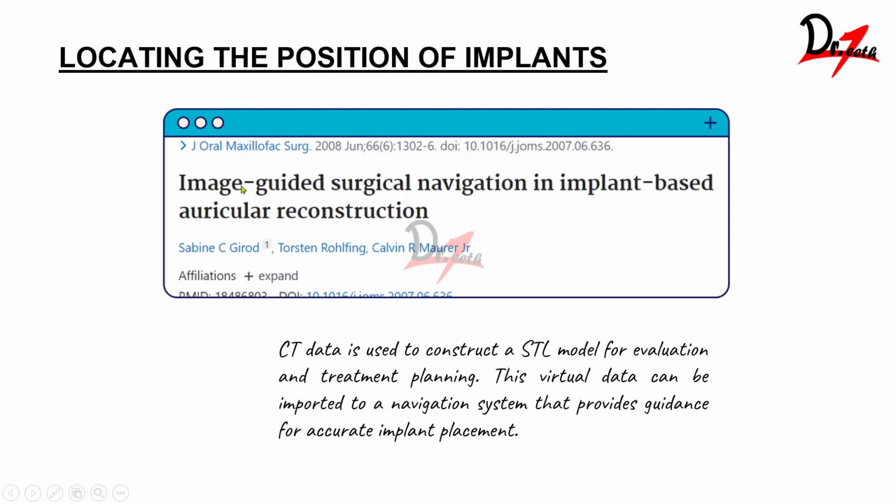One more method is image guided surgical navigation. Here also CT data is used to construct a STL model for evaluation and treatment planning. This virtual data can be imported to a navigation system that provides guidance for accurate implant placement.